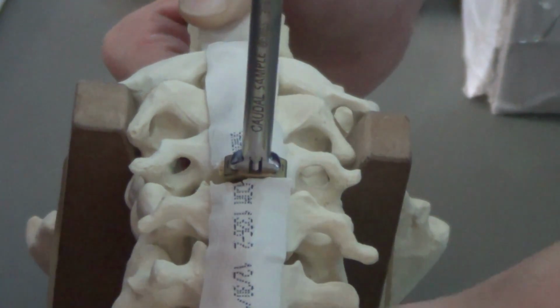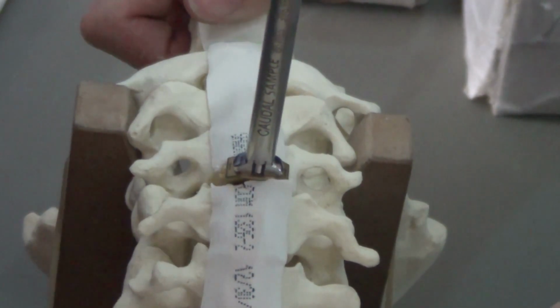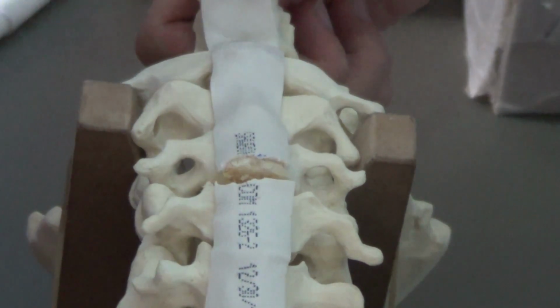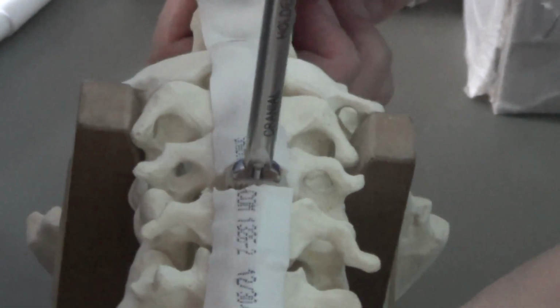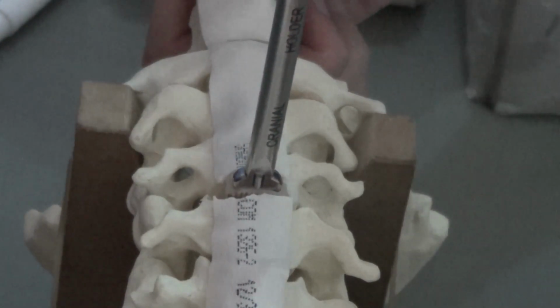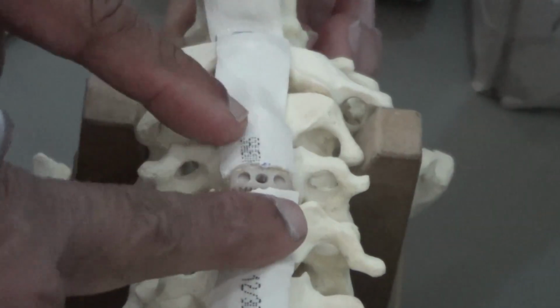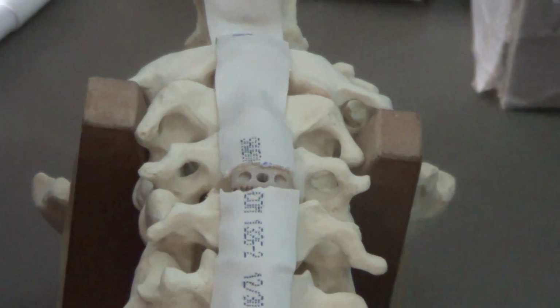unites. But nowadays we want them to start moving around early. What we do, we use a cage. In addition to the cage, there's a smaller cage. You use this. You see, once you put this cage with the bone graft, and then you remove this. You see, you remove the pins, then you find it's quite stable. But to add in more stability, nowadays we use a plate, an anterior cervical plate.